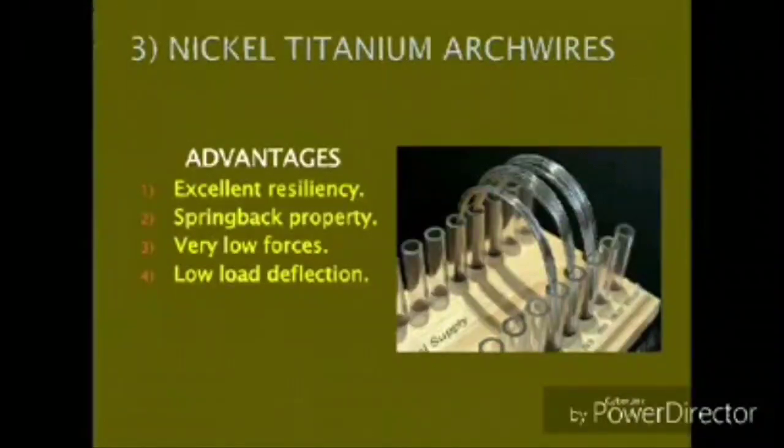Nitinol exerts very low forces and has a very low modulus of elasticity. These low forces are beneficial as they prevent root resorption and maintain the periodontal health of the tooth.